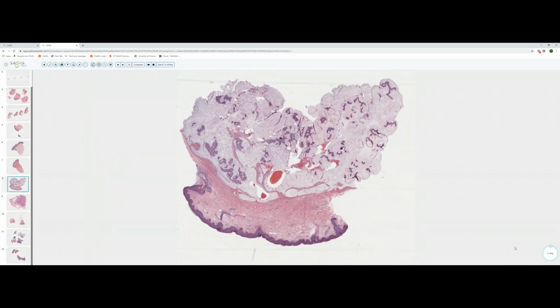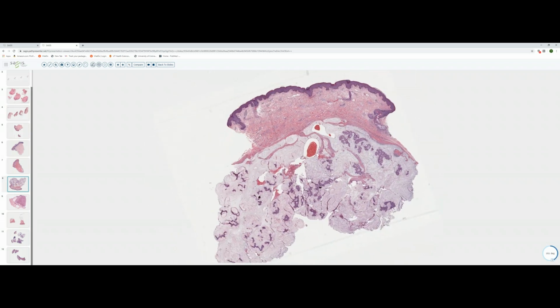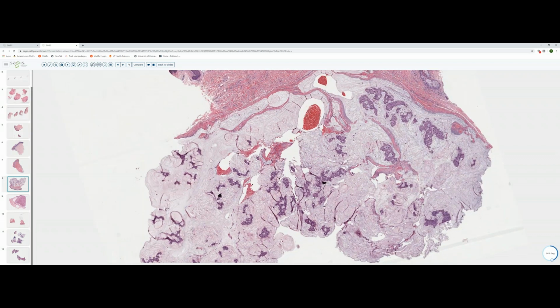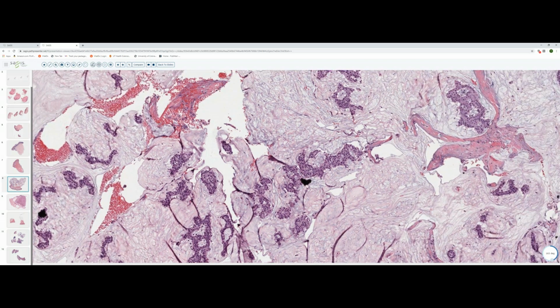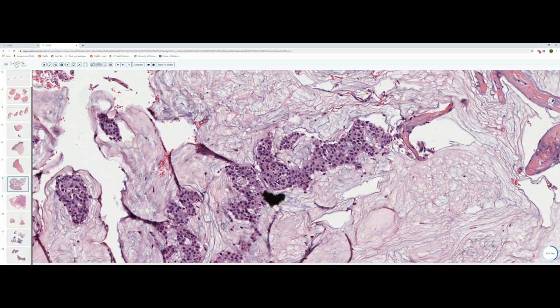Slide 8, we're out of inflammatory land and into neoplastic land. And this is one of these tumors that once you've seen one, you'll automatically recognize it. This is a punch biopsy, partially sampled tumor, transected. And one can see these cord strands and nested aggregates of epithelial cells, which really do not have that much atypia. A little bit of nuclear pleomorphism, but certainly not a high mitotic rate.